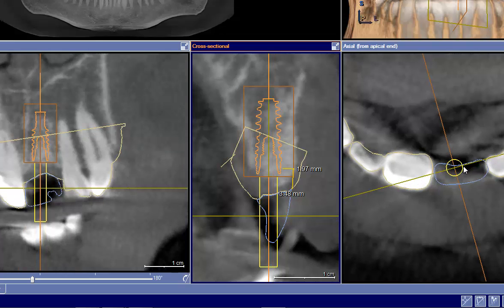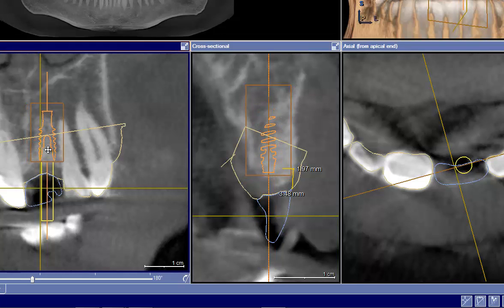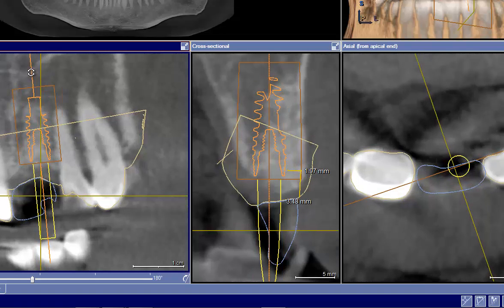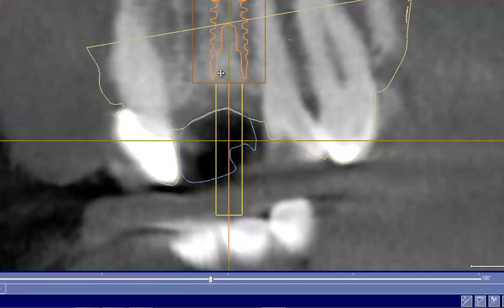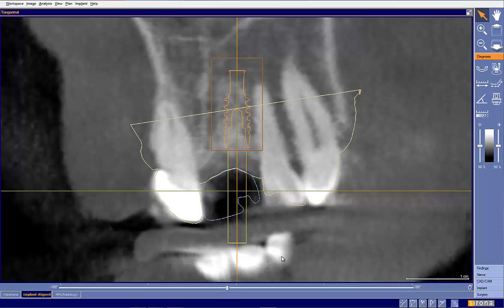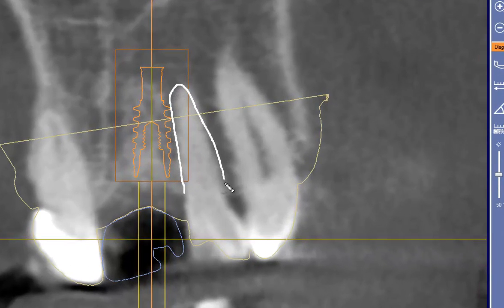And then the next thing I want to do is get this moved over and through the center. Now I'm too close to this root right here. So what I'm going to do is gently go like so. And now what I want to do is notice right here how these roots, let me draw in here for us, just to better show us what it is I'm looking at. If we look, and again, I'm a big fan of just mental visualization. If we look right here.